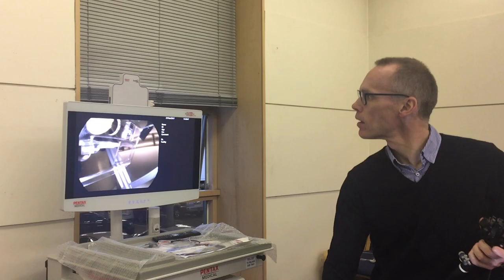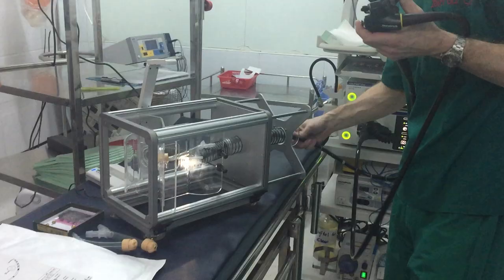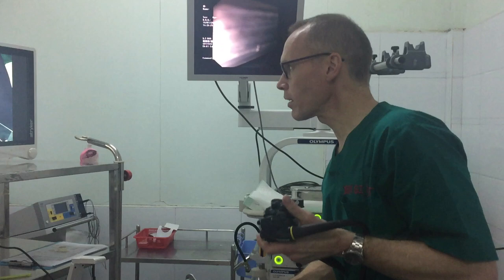Hello, my name is Martin James. I'm a HPB endoscopist from Nottingham University Hospitals and together with Dr. AAT we've constructed some basic videos for ERCP. This video is all about achieving selective biliary cannulation, talking about how we approach the papilla, our composite movements and how we can start by getting successful deep cannulation. We hope to demonstrate both on the Cook Endo training model and picture-in-picture with some real cases, techniques to try and access the bile duct at the start of your ERCP career.